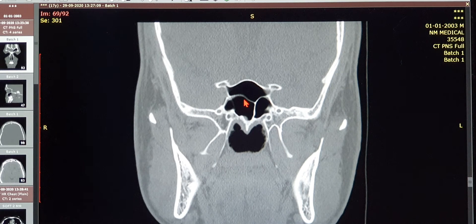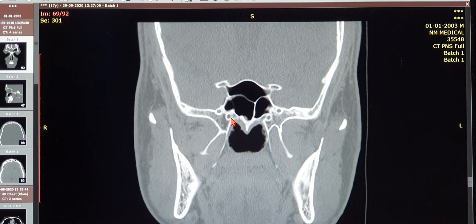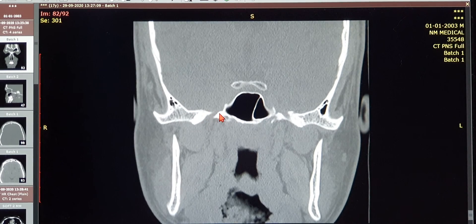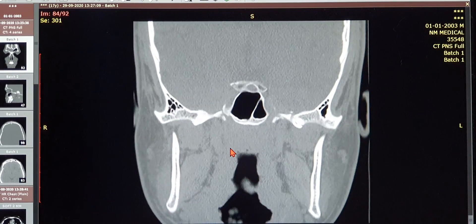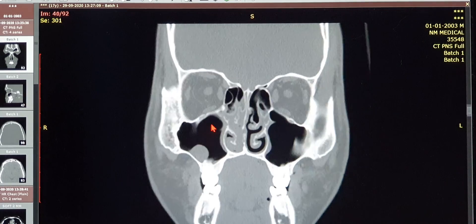The Onodi cell is essentially the persistent posterior-most ethmoid cell projecting the sphenoid sinus downward. The two prominent canal projections visible are the maxillary nerve (V2) at the foramen rotundum and the vidian canal — the vidian is always medial. We can also see the two pterygoid plates and the foramen ovale, which is the discontinuation for the origin of the mandibular nerve.